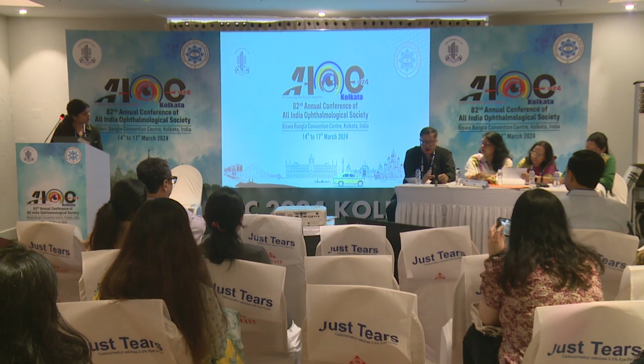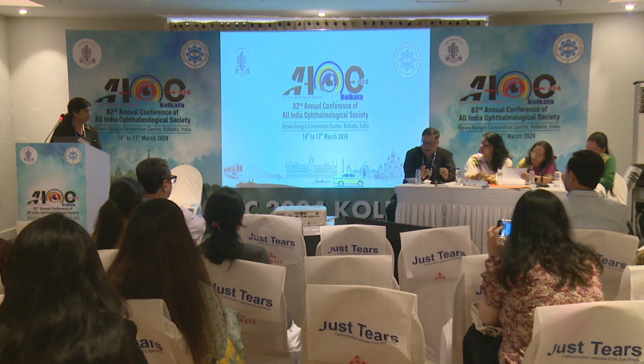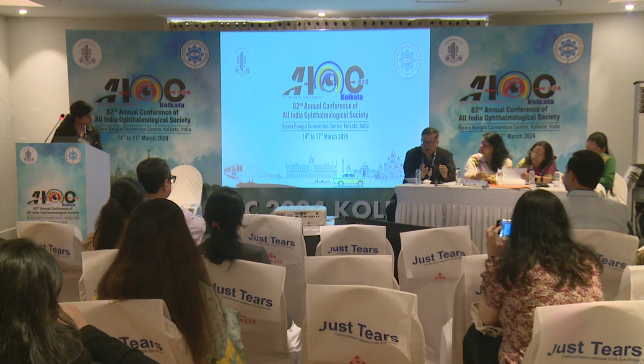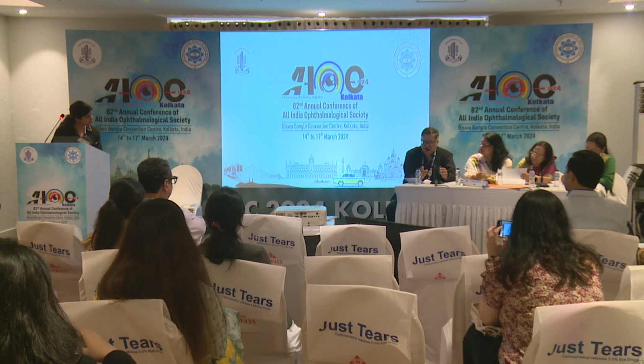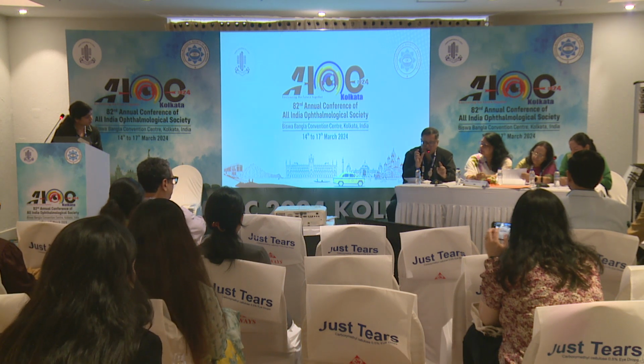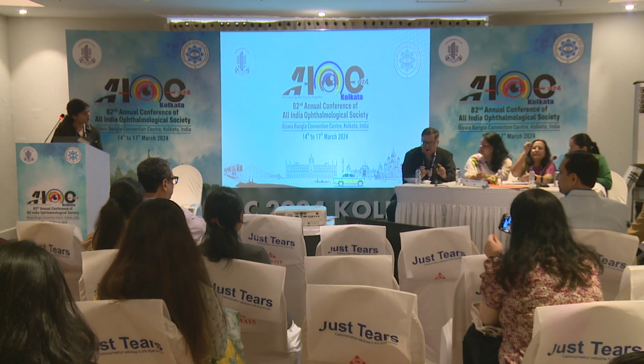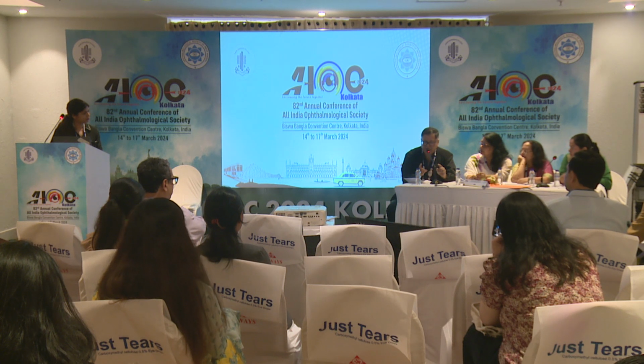Anyway, have you quantified your incisional size? Sir, it was 2.8 mm and it was biplanar, sir. Have you quantified the incision planning, the incisional size, according to the preoperative astigmatism you have found, because it has a very important role.